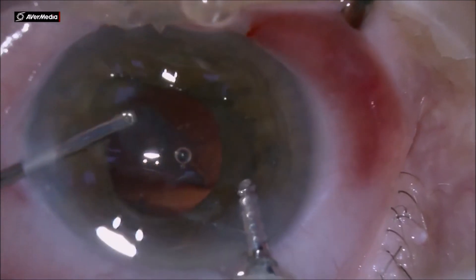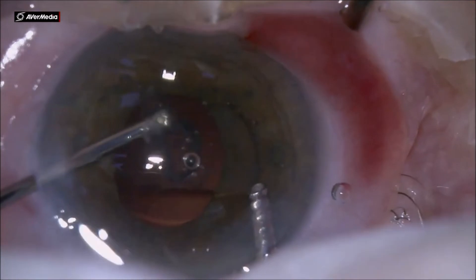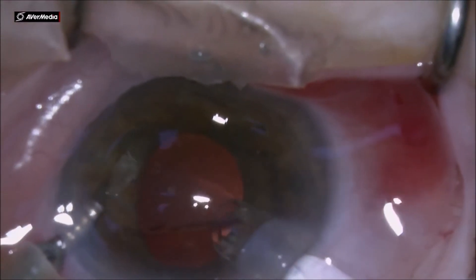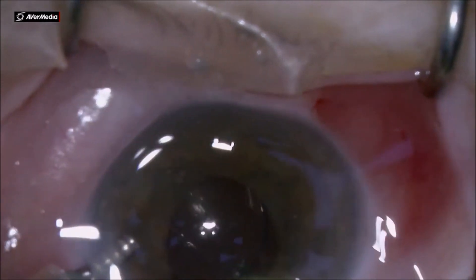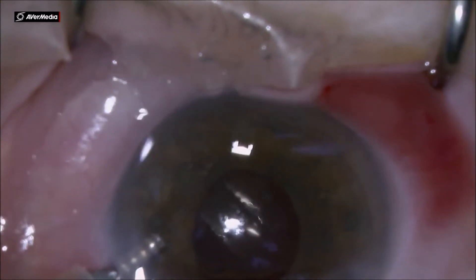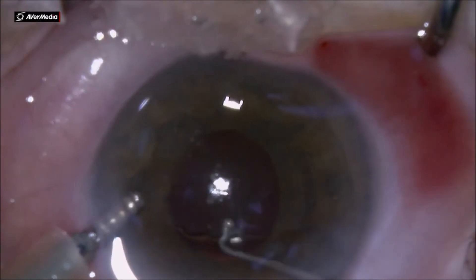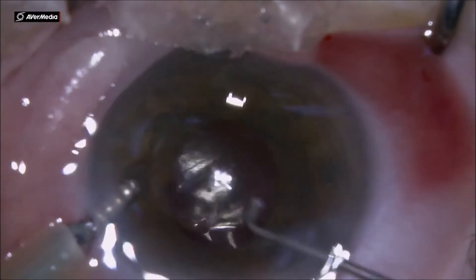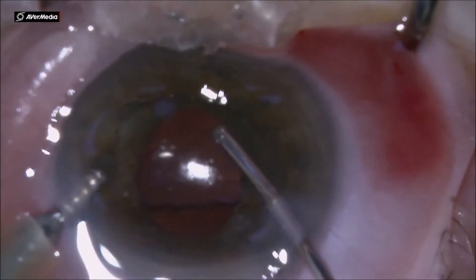Using irrigation through an AC maintainer placed into the main incision, I take out the remaining cortex. I then inject the IOL under irrigation from the AC maintainer, pushing the trailing haptic inside the bag, rotating the IOL into position with the injector, and cleaning up the anterior chamber from the remaining viscoelastic.